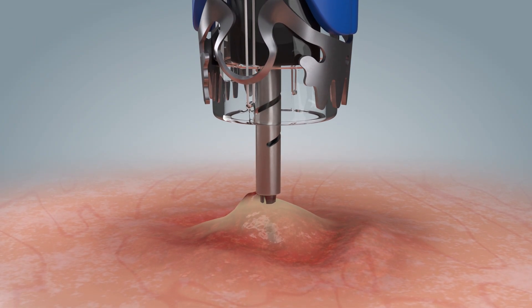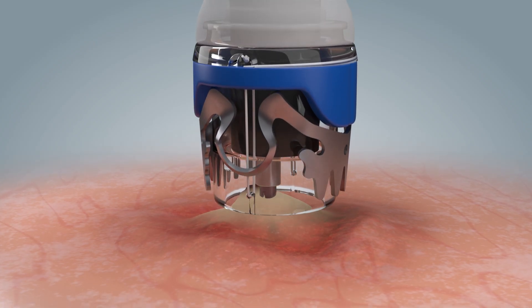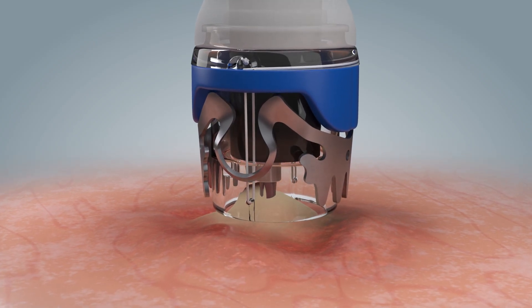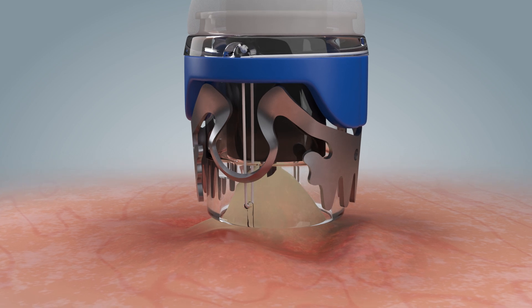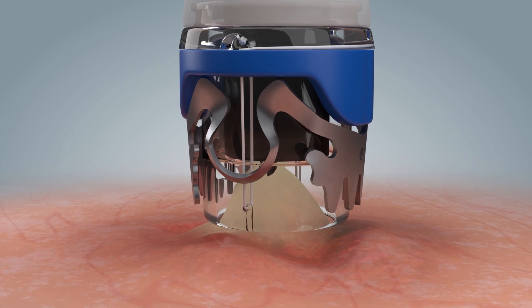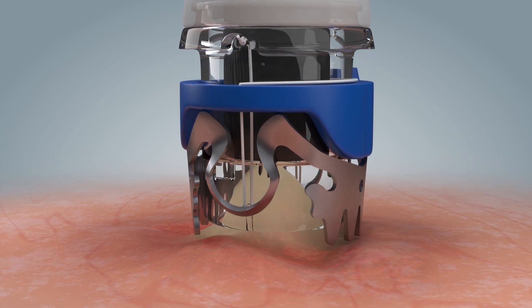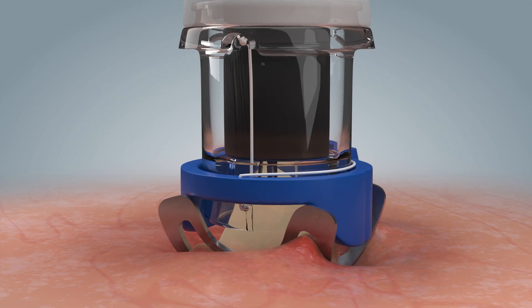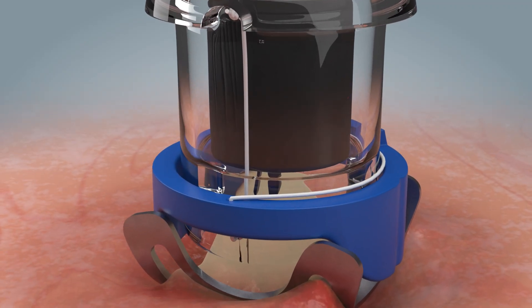In some cases, it may not be possible to fully mobilize fibrotic tissue into the cap. In this case, it is sufficient to pull the tissue to the edge of the cap with the OTSC anchor and then deploy the clip. The clip jumps slightly forward when released and is thus able to grasp tissue in front of the cap.